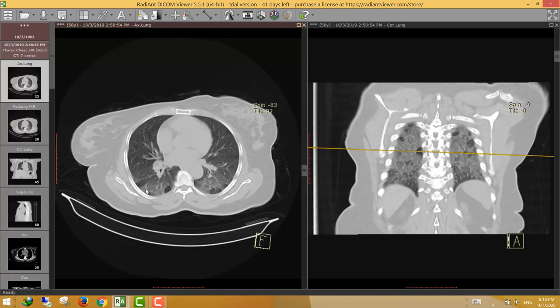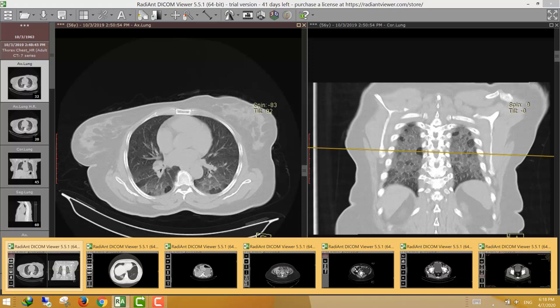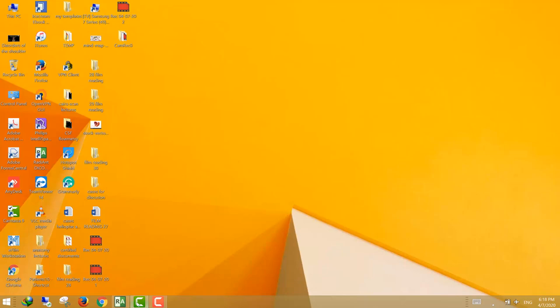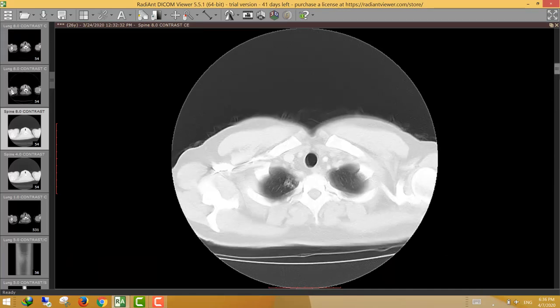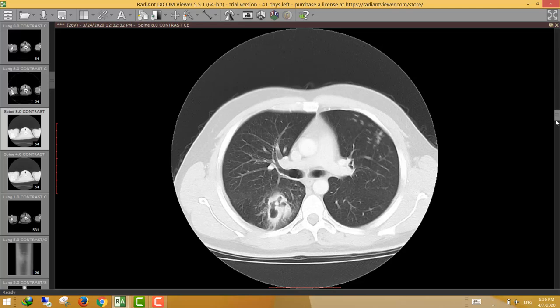After asking the patient, she confirmed she had contact with birds and was raising birds. This is typical for subacute hypersensitivity pneumonitis — also called bird fancier's lung — consistent with the CT findings of ground glass areas intermingled with air trapping in a mosaic pattern.